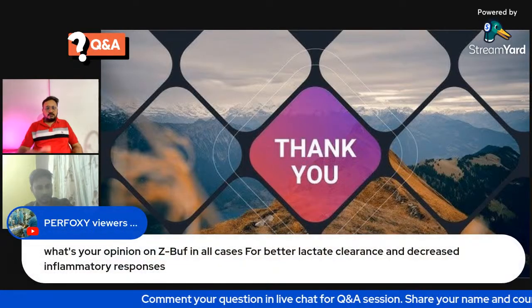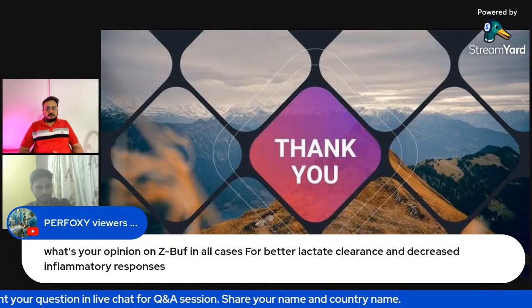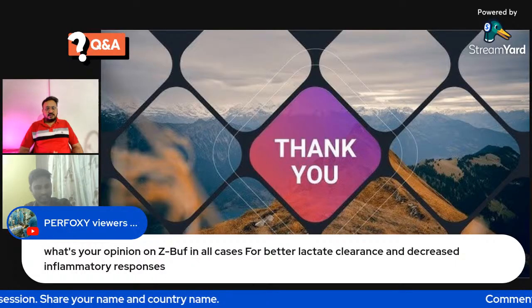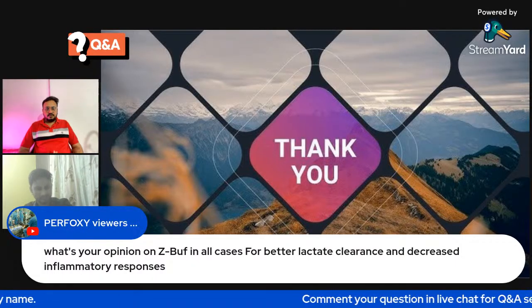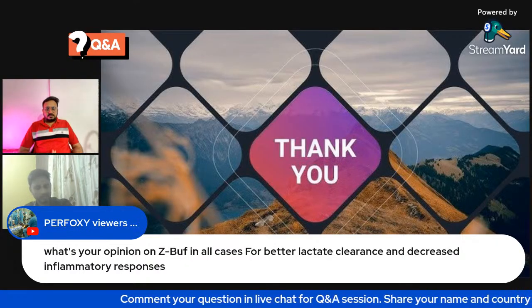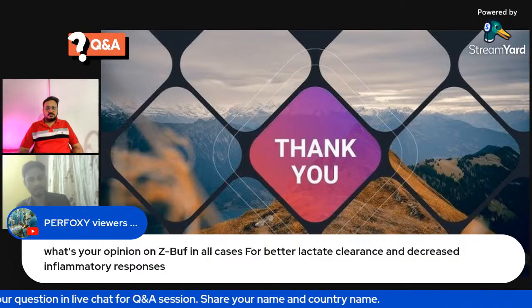Okay. So we have one more question. What's your opinion on ZBUF in all cases for better lactate clearance and decreased inflammatory response? ZBUF is very useful for correcting hyperkalemia.